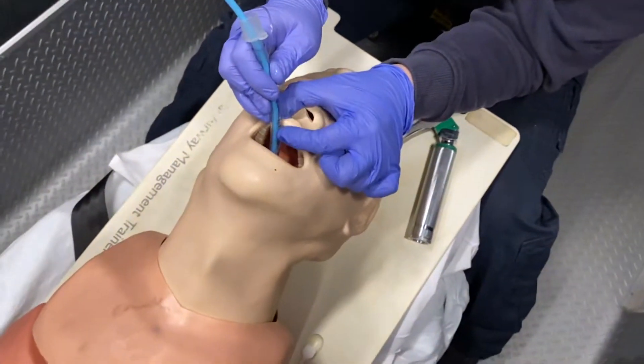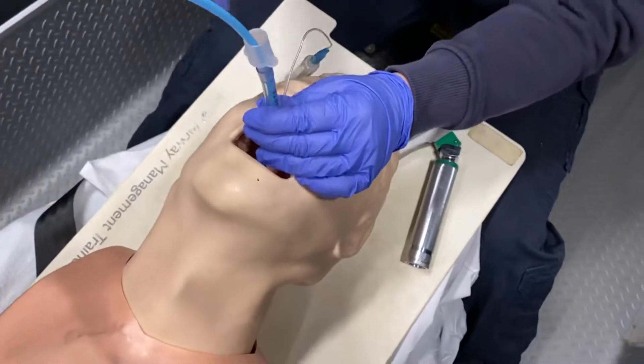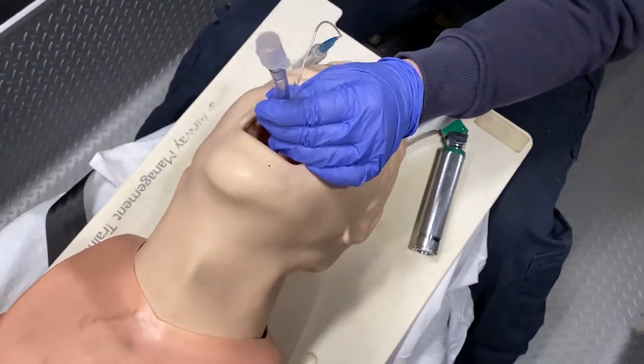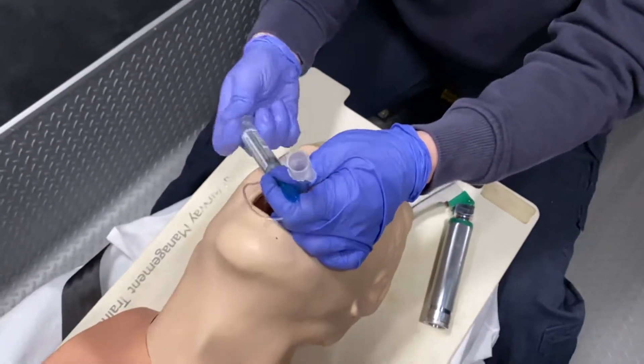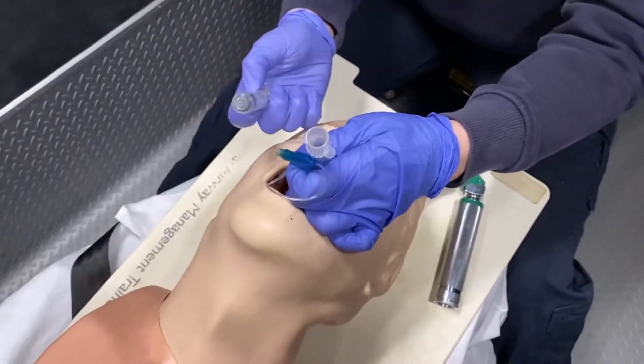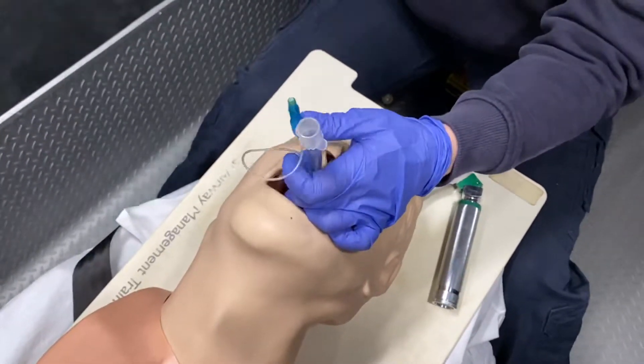Remember, with all intubations we never want to go past Christmas — you should never be inserting a tube more than 25 centimeters into your patient, to avoid a right main stem bronchus intubation. Go ahead and inflate your balloon, and make sure you don't let go of your tube. Always disconnect your syringe as soon as the balloon is inflated.